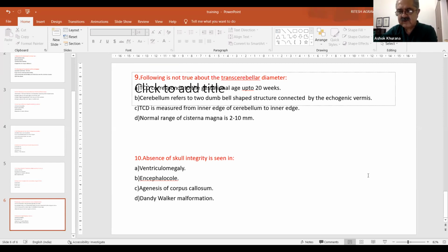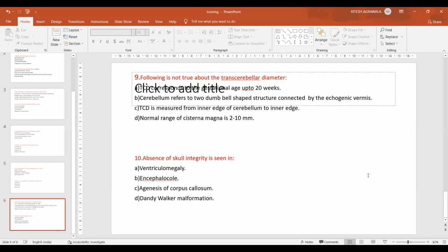People can clock in the number of hours and make sure they've completed at least that much, with at least 50% under supervision, so that this inexpensive technology is put to great use, because in the long run, we really have very excellent ultrasound-based diagnosis and prognosis.